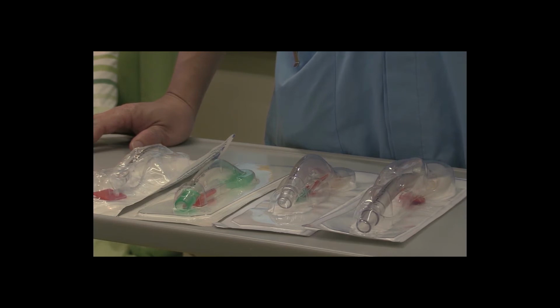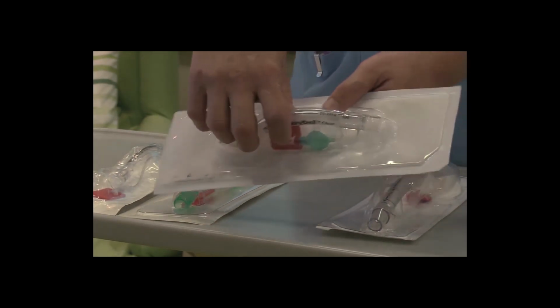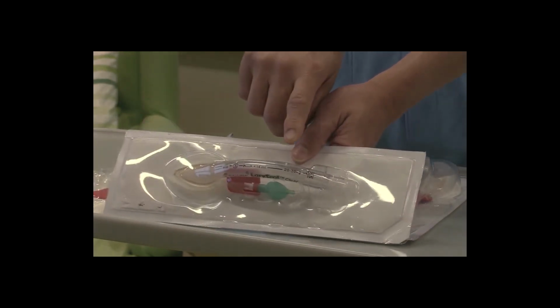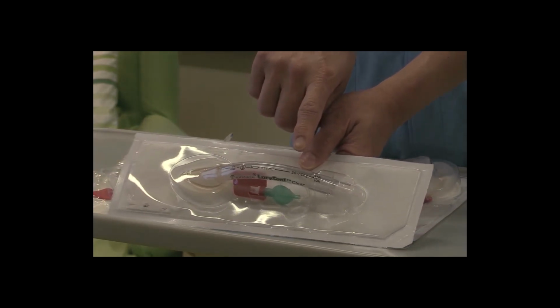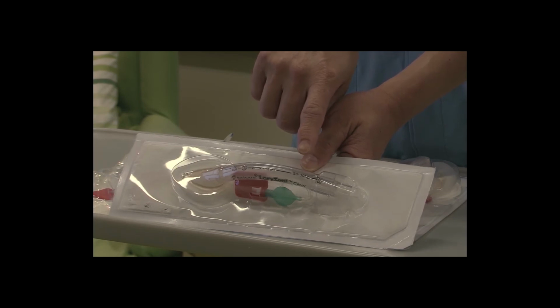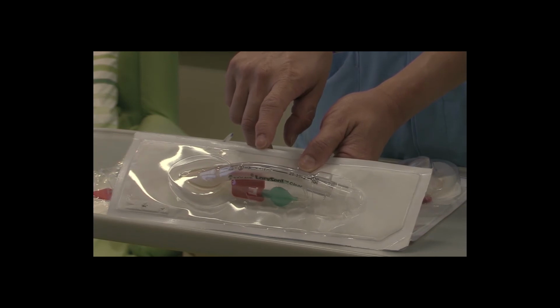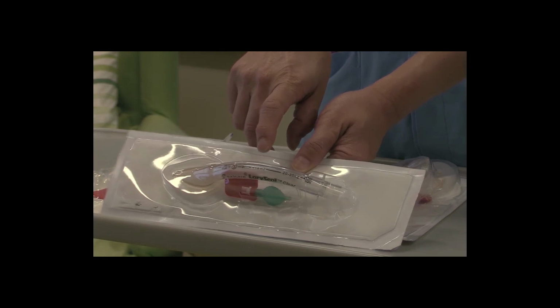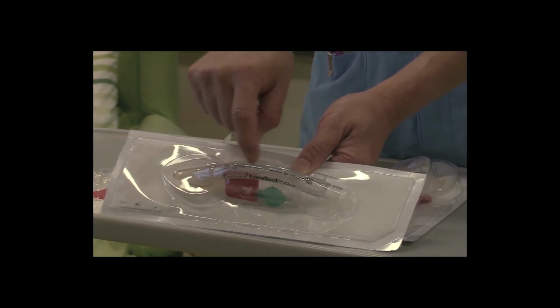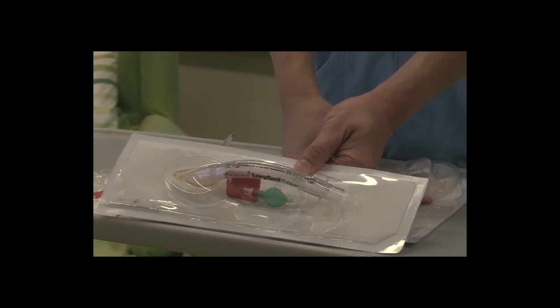Laryngeal mask airways come in different sizes. The choice of the laryngeal mask depends on the body weight. In every laryngeal mask airway, the recommended body weight is printed on the airway, and also the volume of gas to be inflated into the cuff is printed on it. And there's a black line here to remind the operator that this is to be in the midline after insertion.